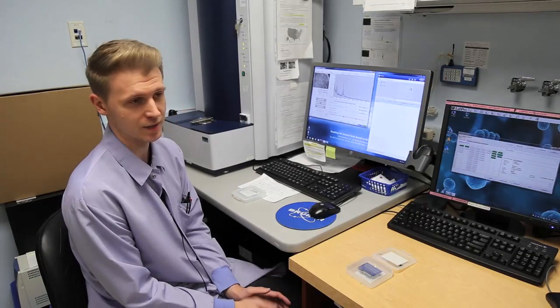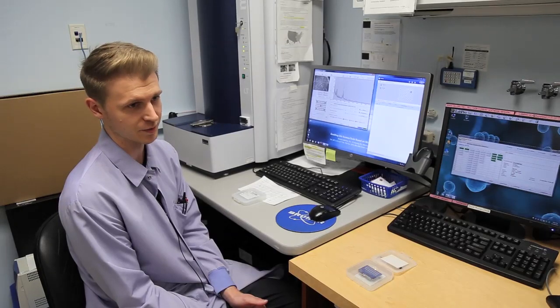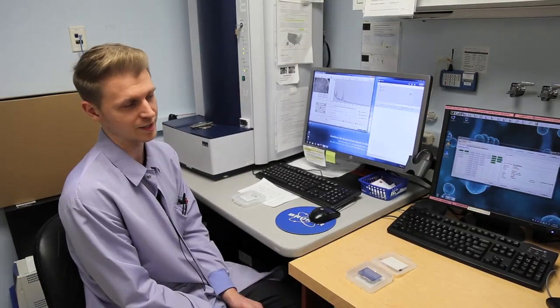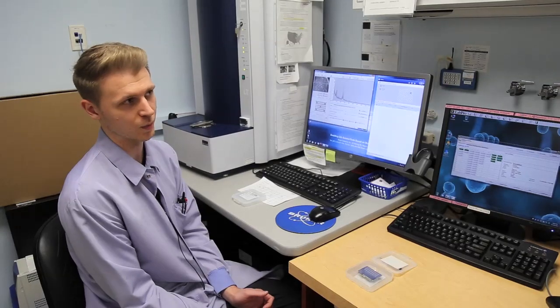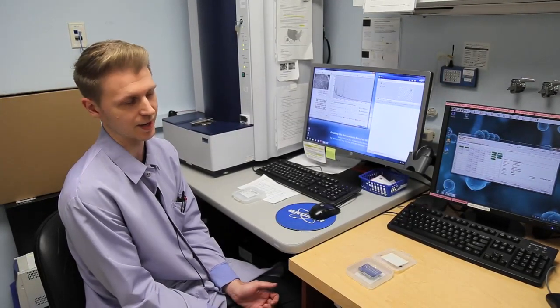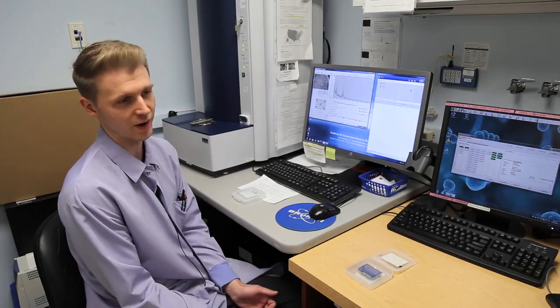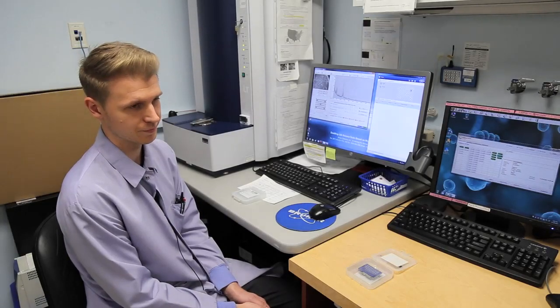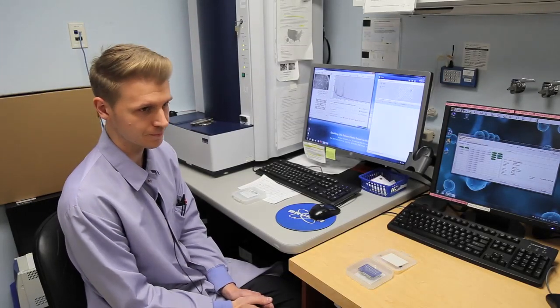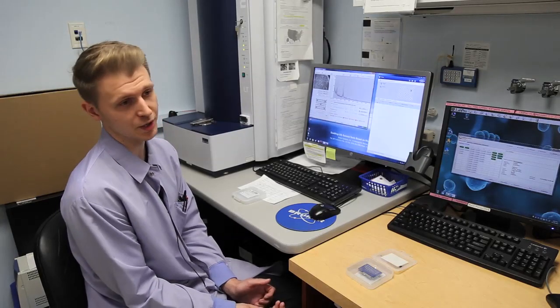So each spot just takes a couple seconds. So it's greatly sped up our process. We've gone to more of a molecular-based method as opposed to before, when it was more based on biochemical characteristics and metabolism of bacteria, which we know can take 24 hours or more. Wow. And because it's from a culture plate, it can be done on just about any specimen that we culture. Oh, pretty much, as long as it grows in culture.